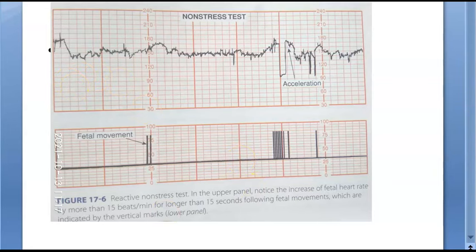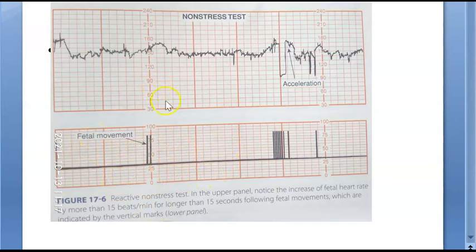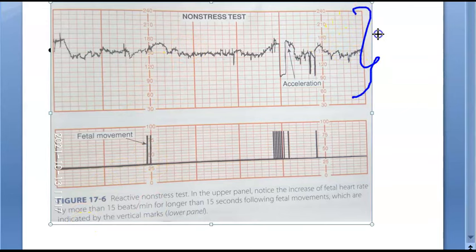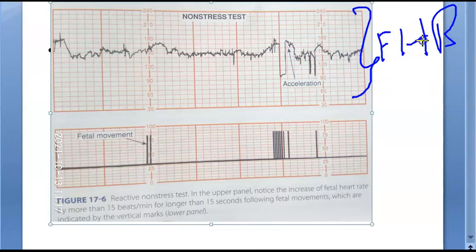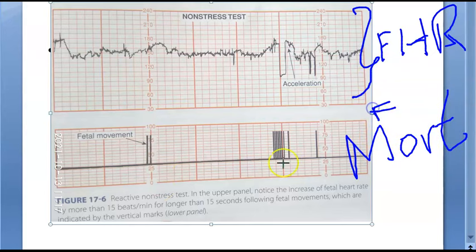The mother's fetal movement input is unreliable — sometimes the fetus may move and she may not report it, or she may mark it in the wrong place. So we won't focus on that. What you're seeing above in the NST is the fetal heart rate. Down below is the mother's perception of fetal movement, which is not reliable, so don't rely on that.